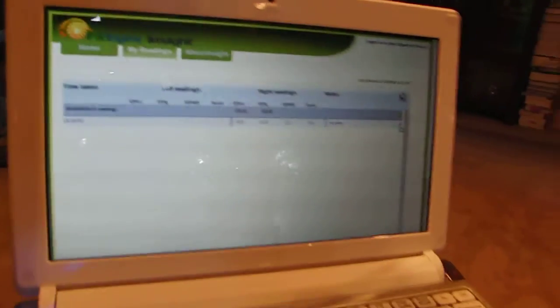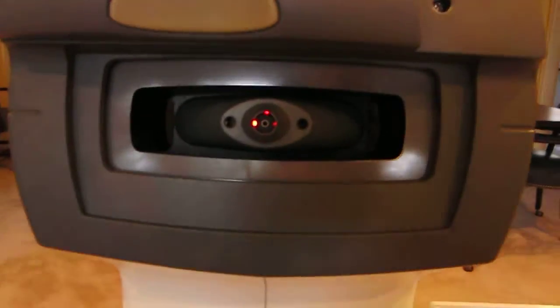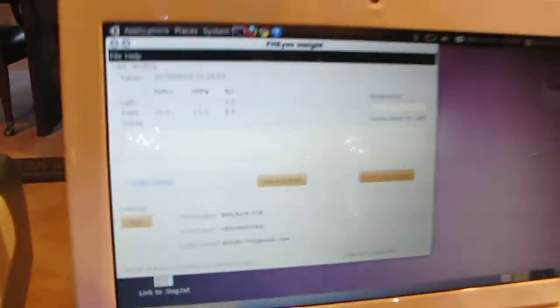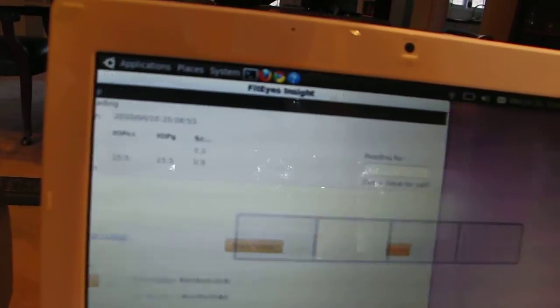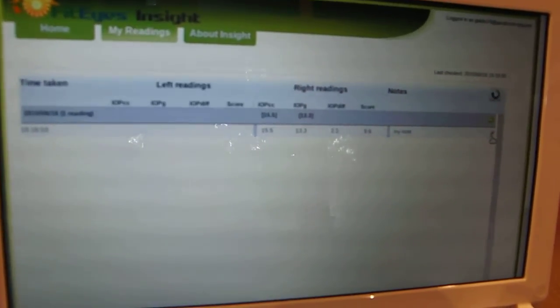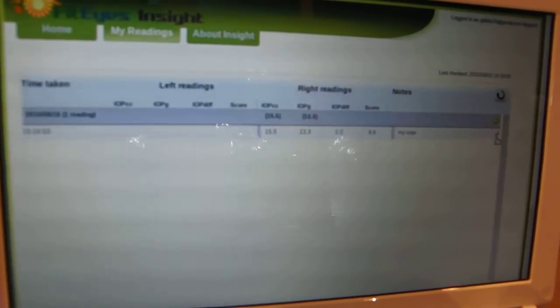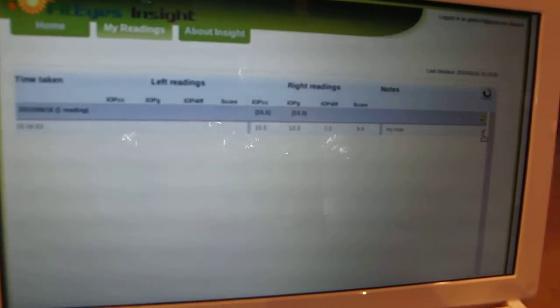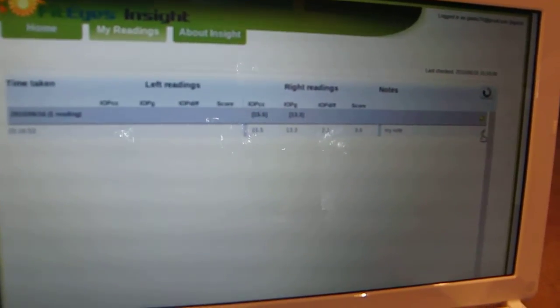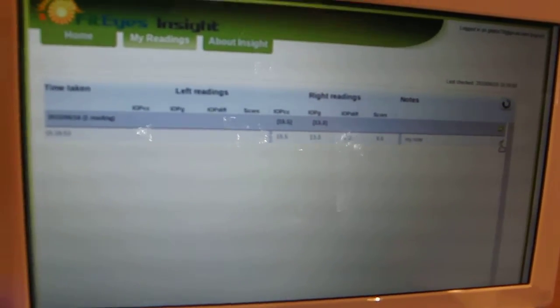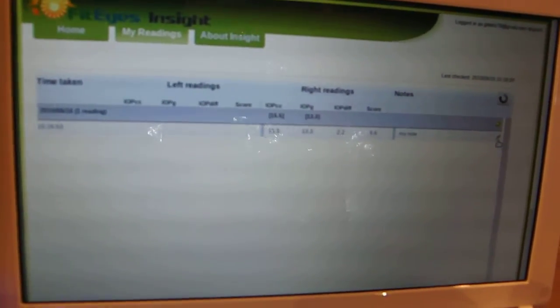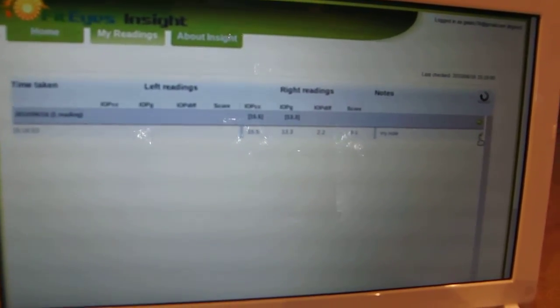So that's how it works. We sit in front of the tonometer, we take a measurement, press the print icon on the tonometer. Measurement automatically appears right here on the computer screen. It's really nice because we get to see it right in front of us from sitting at the tonometer. And the measurements are all collected on the private password-protected web page. And you can see a historical record of all of your IOP measurements here on this web page over time.